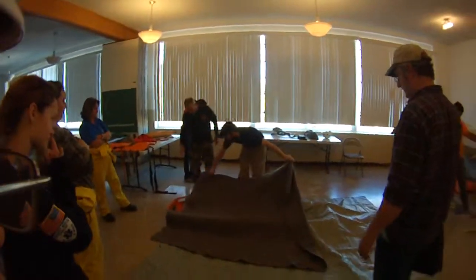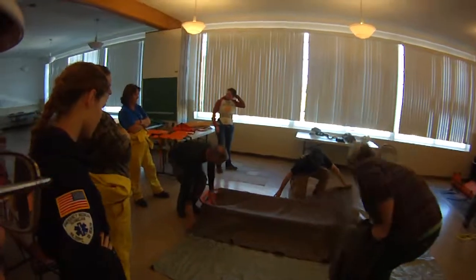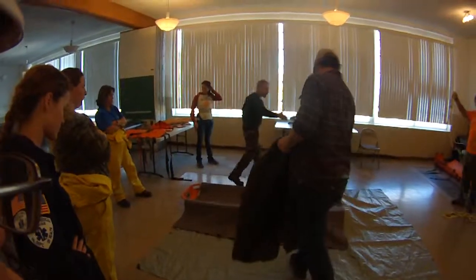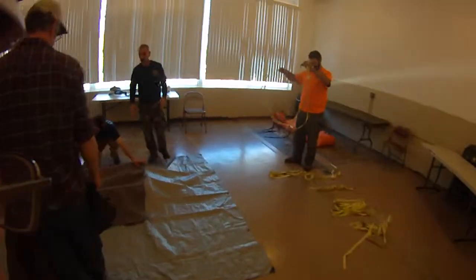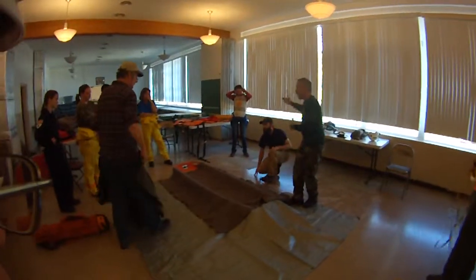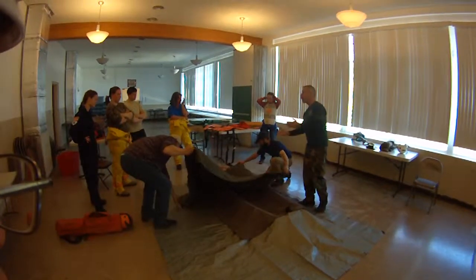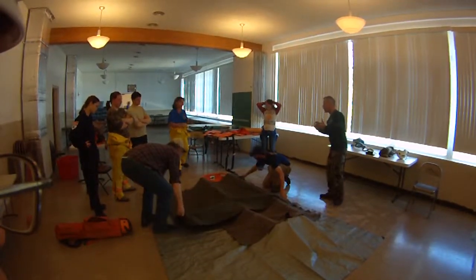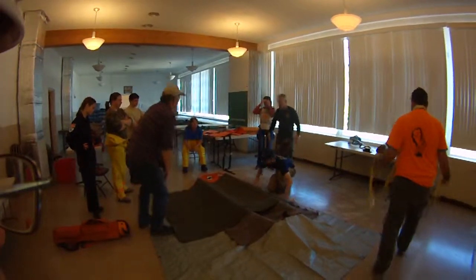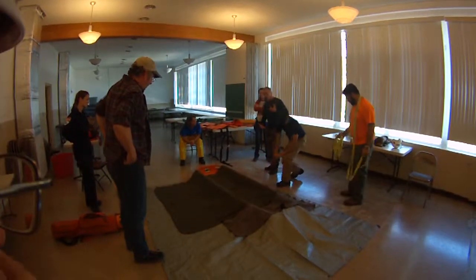Then you put down the blankets. This is actually a little small — I generally like this a little longer so it will extend out further and extend down here, because ideally what you want is long enough so it will fold over her feet. Heather is small enough that we will be able to fold some of this over her feet. It's all about trying to keep the core as warm as possible. That's the reason we put the second blanket just around the core — we want to keep that as warm as possible.